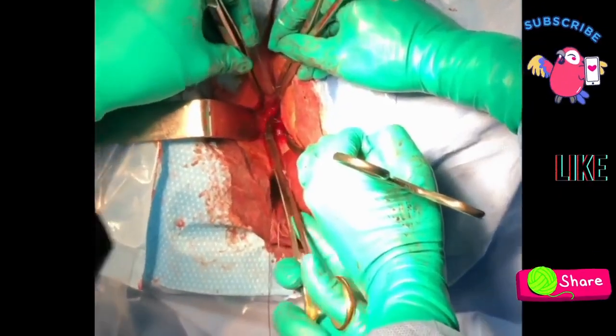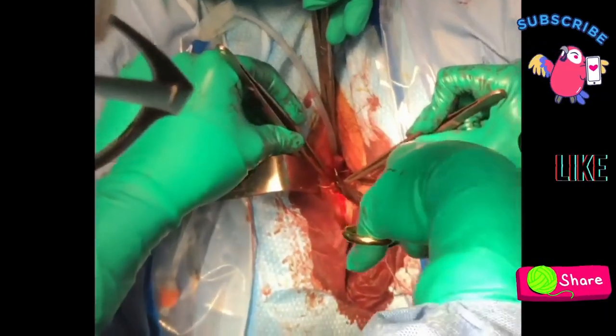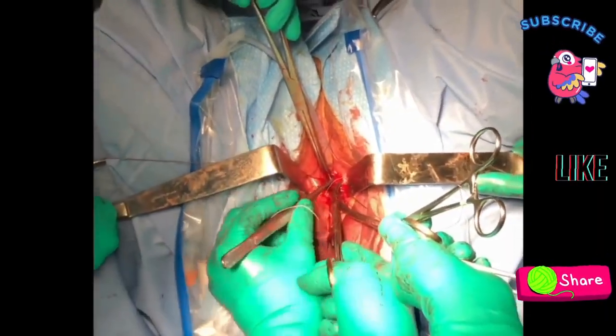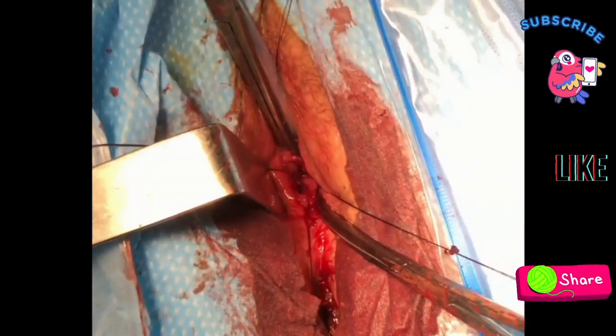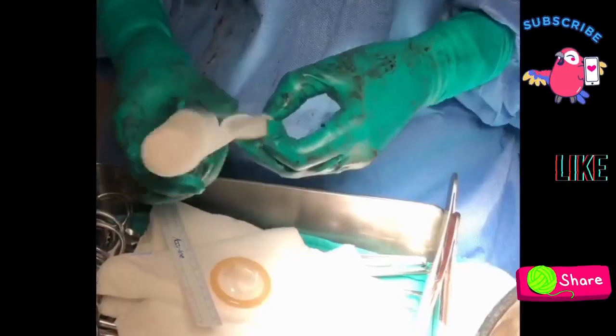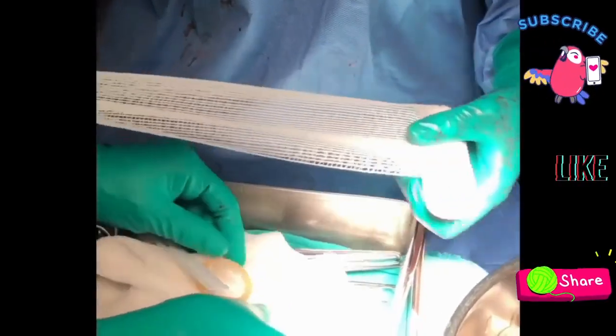The peritoneum is then sutured to the mucosa of the vaginal vestibulum using 2-0 Polysorb or Vicryl sutures. This is performed circumferentially in a simple interrupted fashion. Sutures are held with snaps and only tied down once all stitches have been placed.